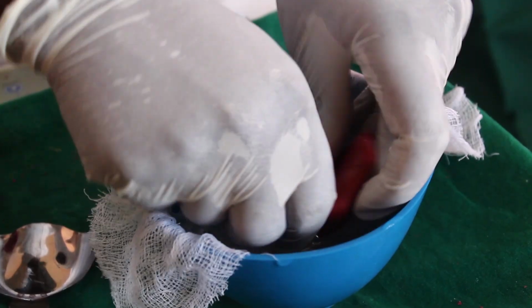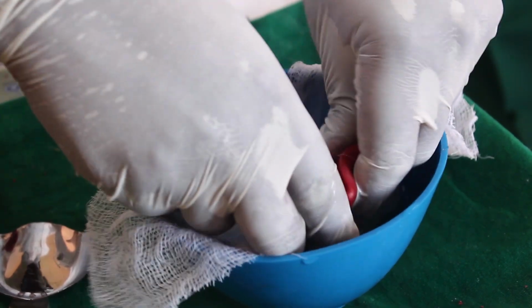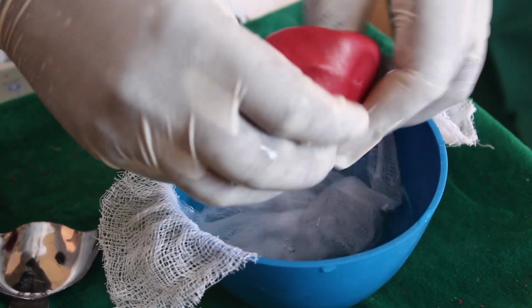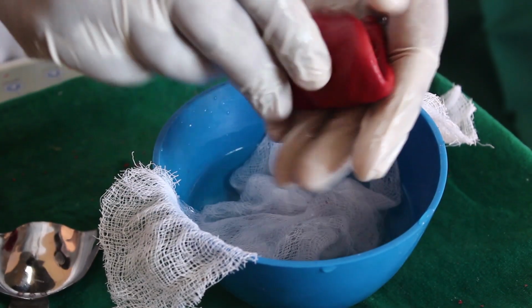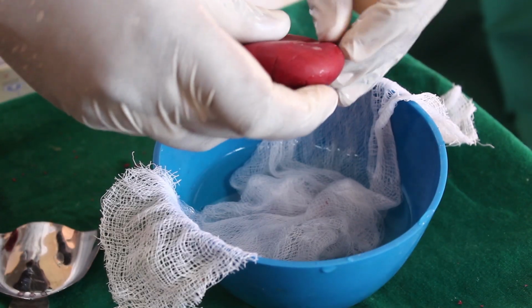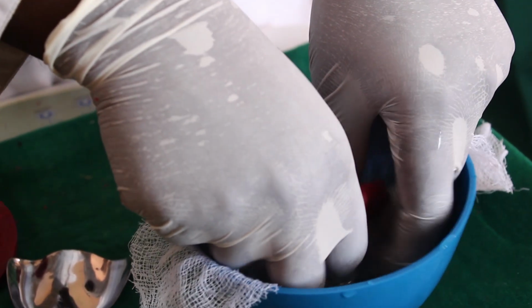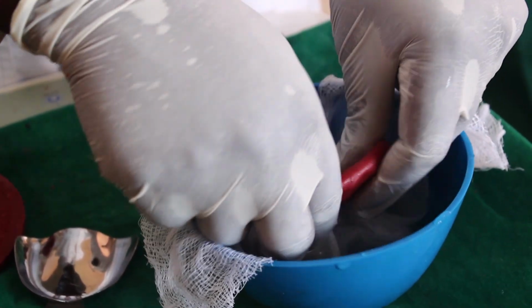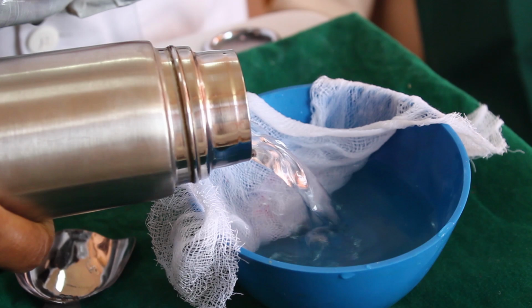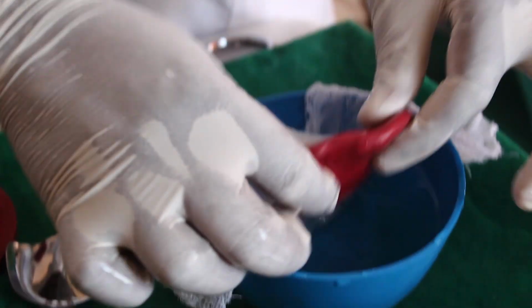So the material is now pliable, so I am going to knead the material adequately. So I made it into a uniform mass.